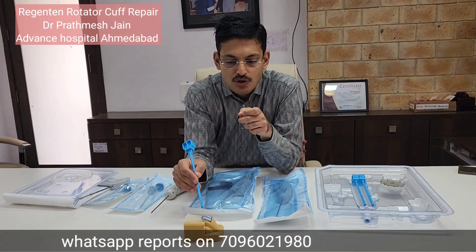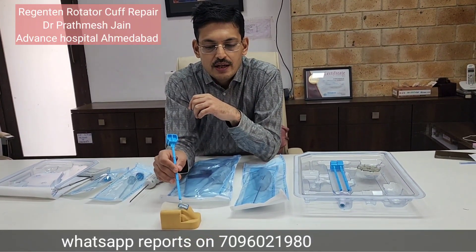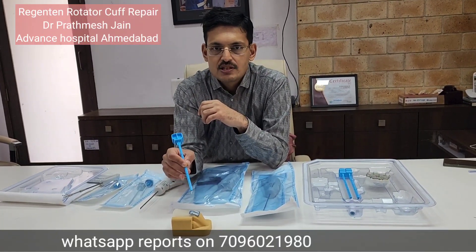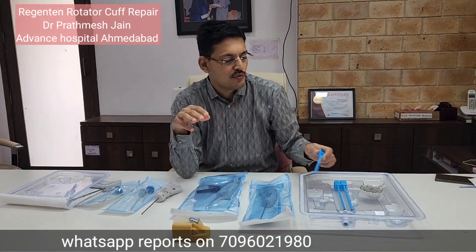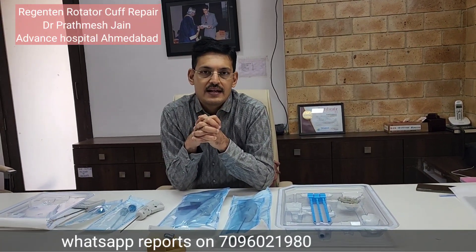Once the patch covers the entire repaired area of the cuff, it does two things: it covers the whole repair, and it increases the biology while providing biomechanical strength. At about two millimeters in width, it creates a biologically inductive environment and protects the repair from retears. Postoperative pain in these scenarios is also very less. The only limitation of this system is the cost — it is quite expensive and can only be done for patients who are financially able or insured. However, we are trying to make this high-level surgery accessible to the common Indian man — that is our goal.